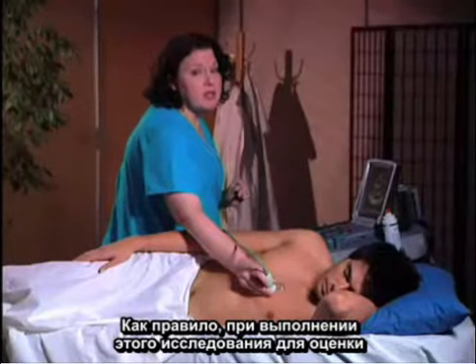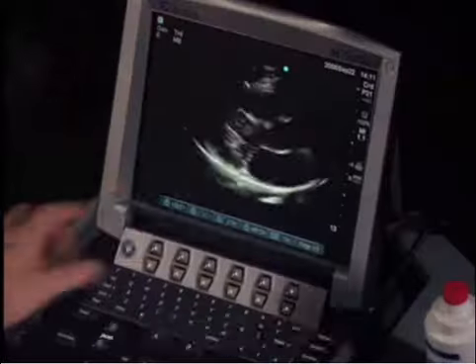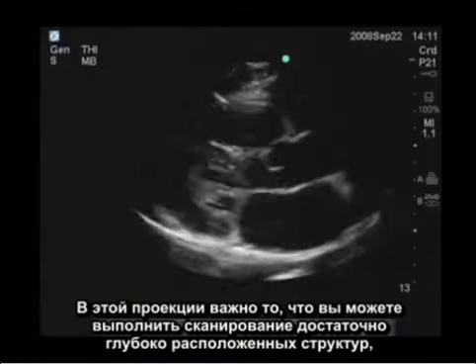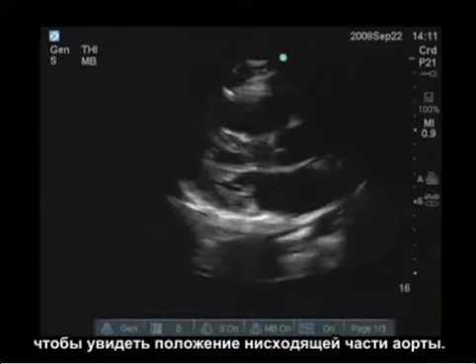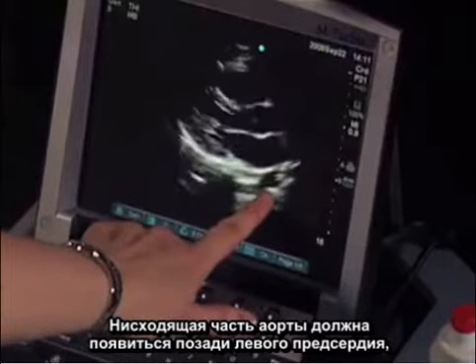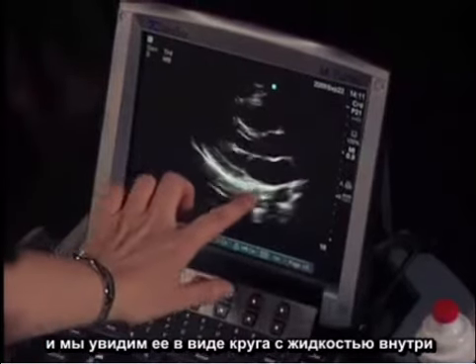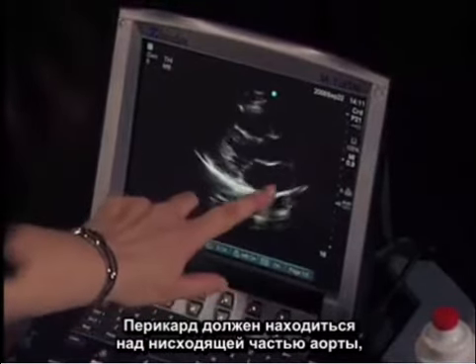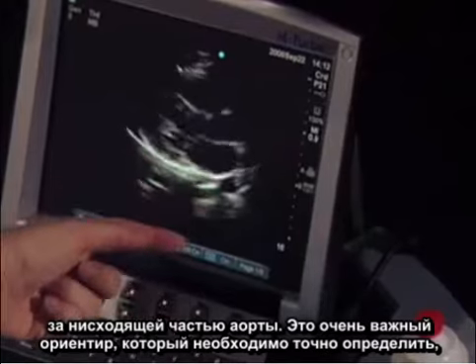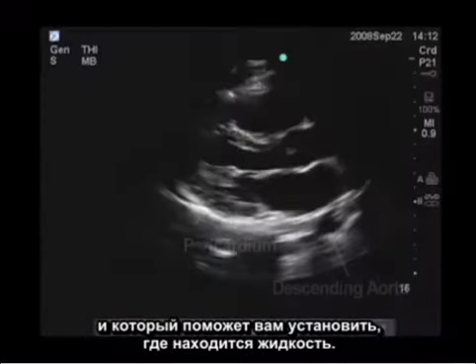Typically, we're doing this examination to evaluate for pericardial effusion. So we want to identify the pericardium. This is going to be this bright white line around the heart. What's important in this view is that you have it deep enough so that you can identify where the descending aorta is. The descending aorta is going to appear posterior to the left atrium, and we're going to see it as a round circle. If the fluid is in the pericardium, it's going to be above this descending aorta. If it's a pleural effusion, it's going to be behind the descending aorta. So this is a very important landmark that you need to identify so you can clearly establish where the fluid is present.